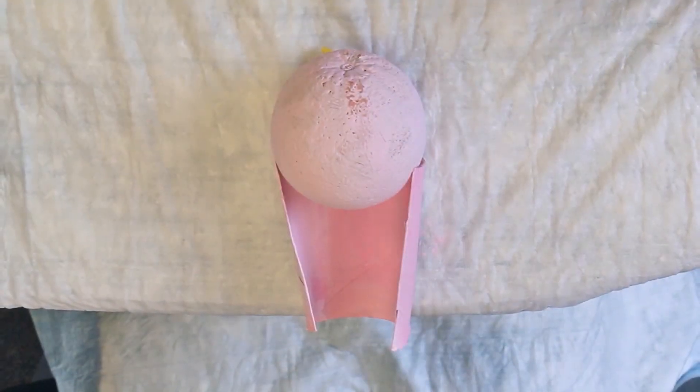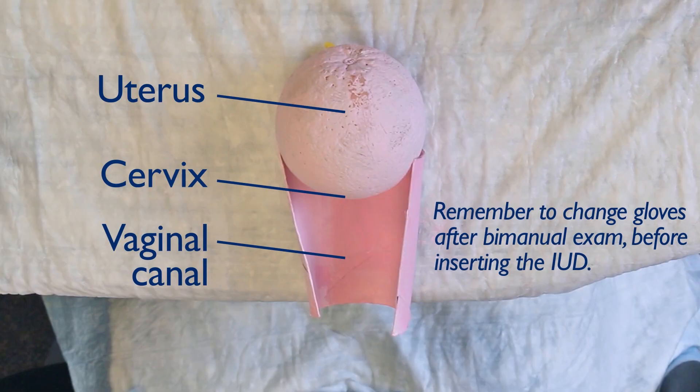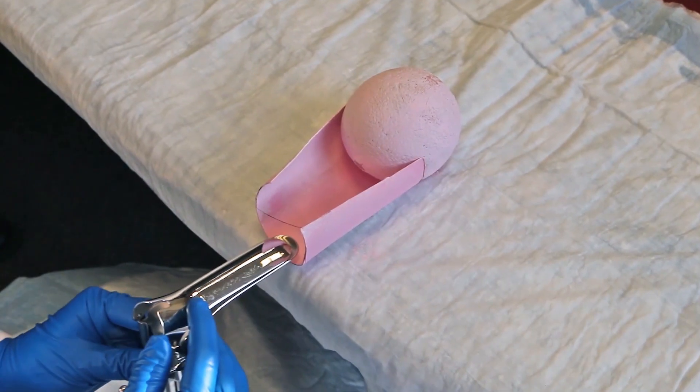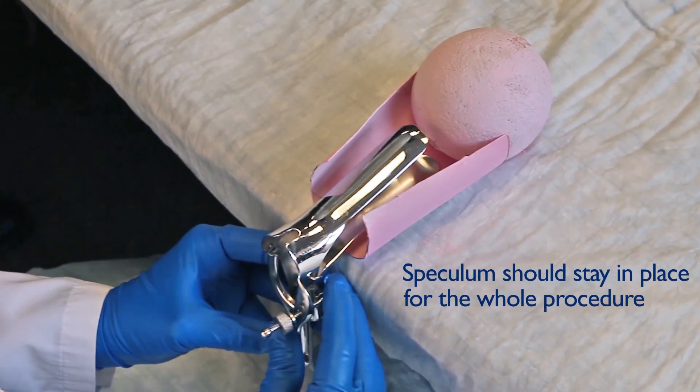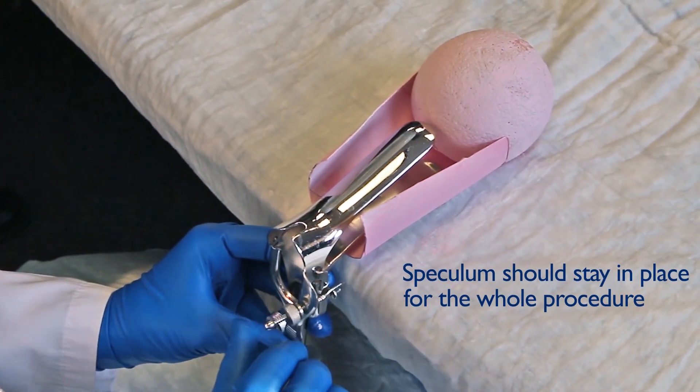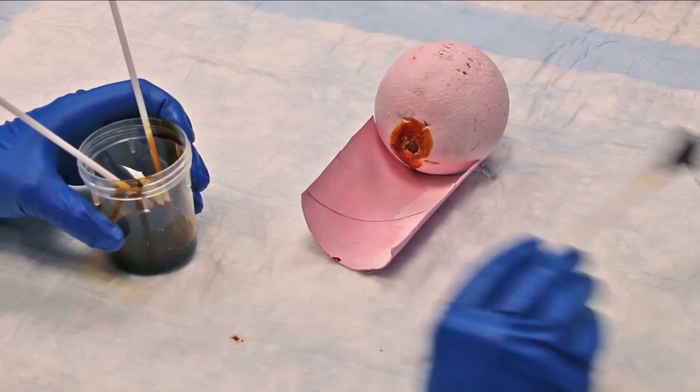Prior to any IUD insertion, you should perform a bimanual exam to confirm the shape, size, and direction of the uterus. Insert the speculum, and clean the cervix two to three times with the antiseptic solution.